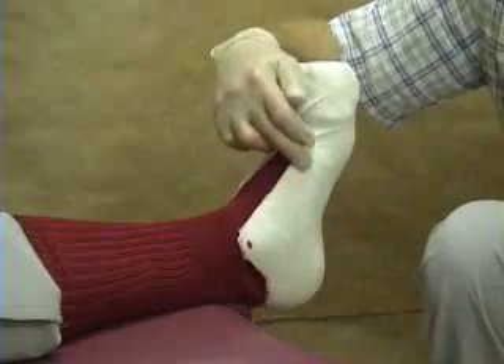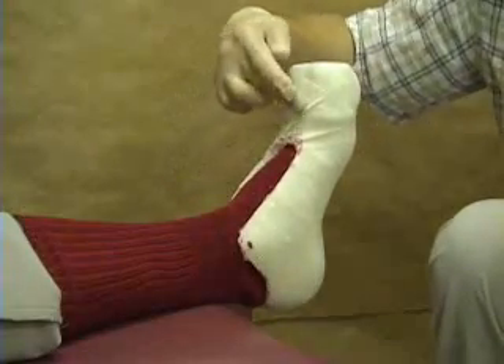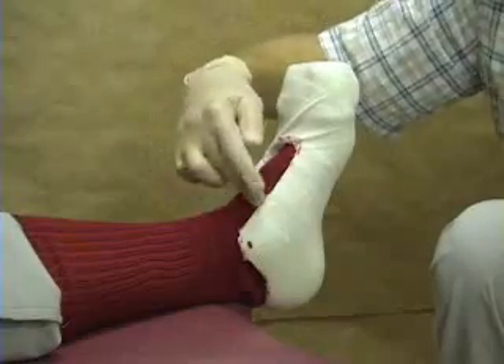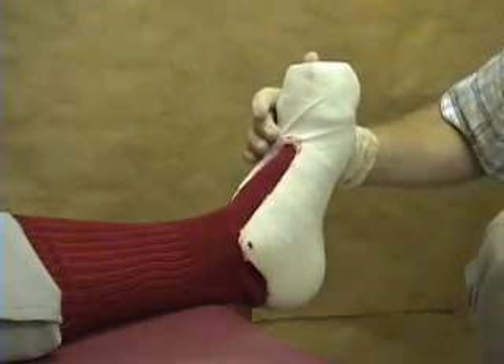The dimensions of that tongue — the thermoplast that you cut out — it needs to cover this part of the foot. In our particular case, it's about 11 by 11 centimetres, but of course that will vary.